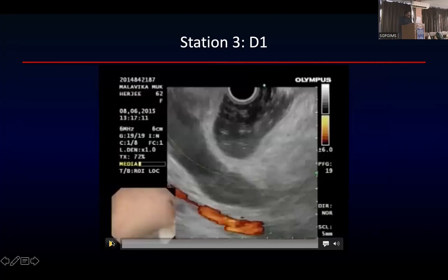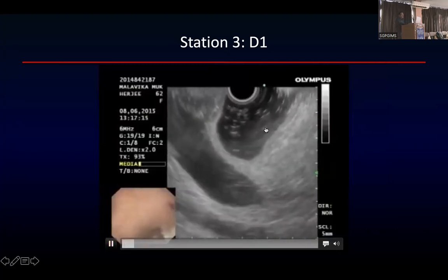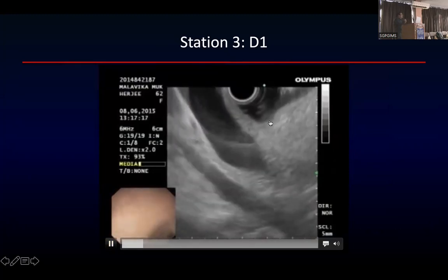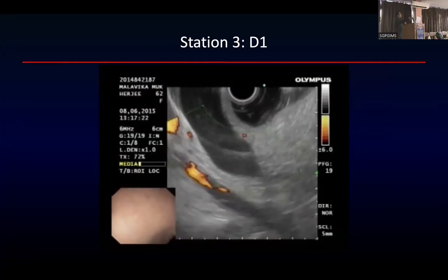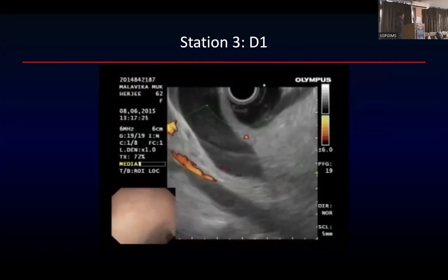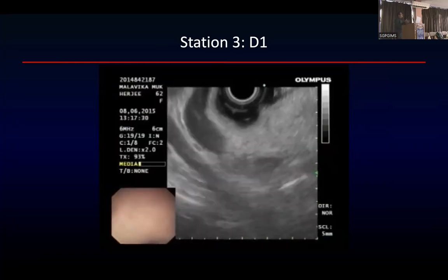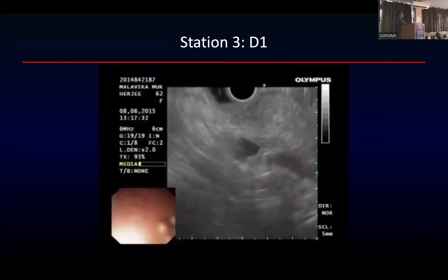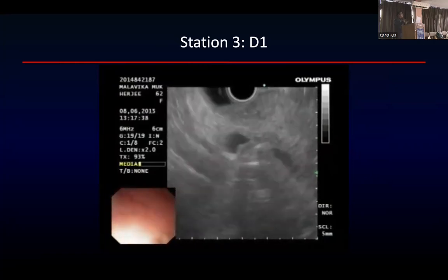So this is a grossly dilated bile duct, and what I have done, you can see I have instilled a lot of fluid. Lot of fluid I instill when I am doing EUS imaging. This is primarily to get a good acoustic coupling. Radiologist क्या करता है, ऊपर जेली लगाता है. आप जेली लगा नहीं सकते. आप पानी से भरते हो, which does the same job as applying jelly. So is that clear? So to get a good coupling, otherwise you will have a lot of artifacts.